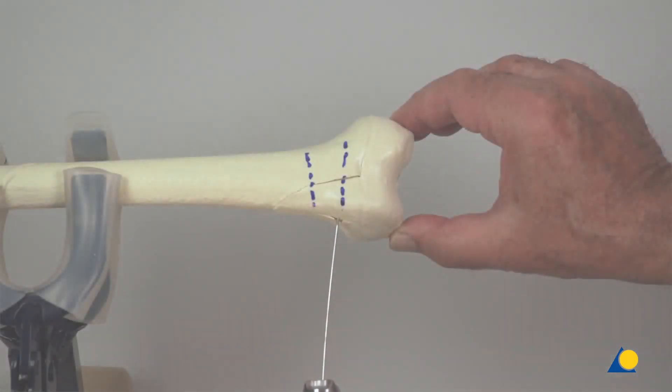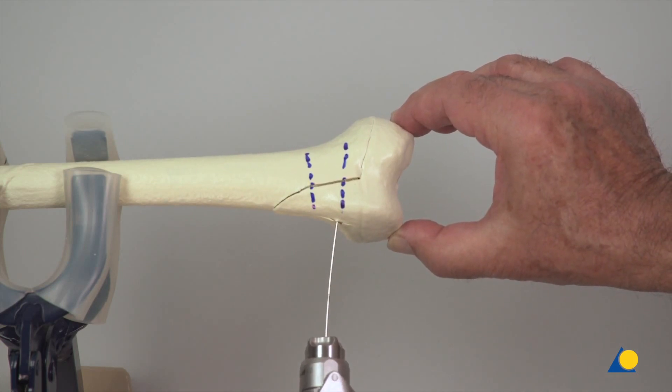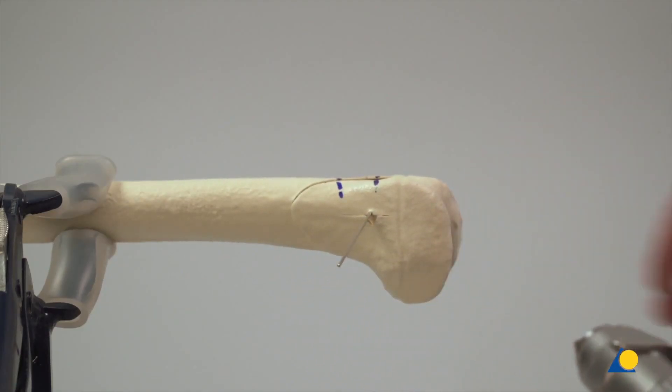Once correct reduction has been achieved, the first guide wire for the compression screw is inserted through the metaphyseal wedge, parallel to the growth plate.